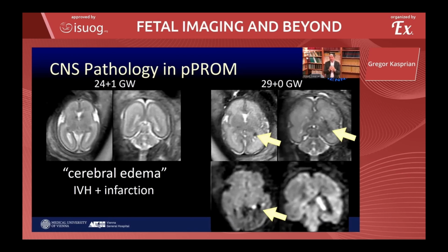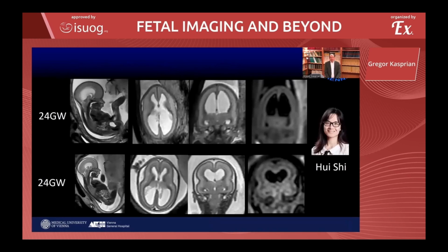I believe strongly that this has to do with venous congestion, meaning due to the compressed state of the fetus, the absence of amniotic fluid, and the absence of the outer CSF spaces, venous backflow is not ideal, and therefore we have congestion, we have perivenous hemorrhagic infarction and intraventricular hemorrhage as a result. So some of our preterm premature neonates may not have their hemorrhages develop after birth. Some of them may have them already before they are born as a result of their anhydramnios.